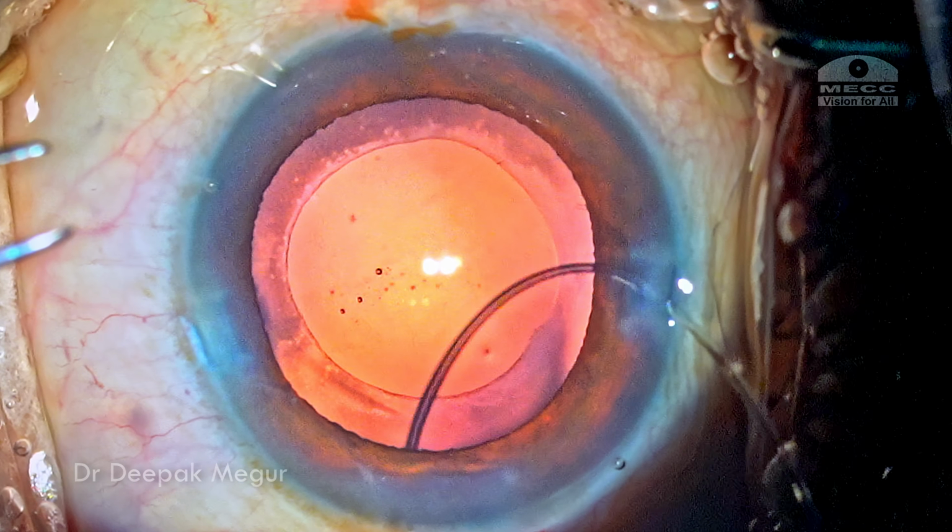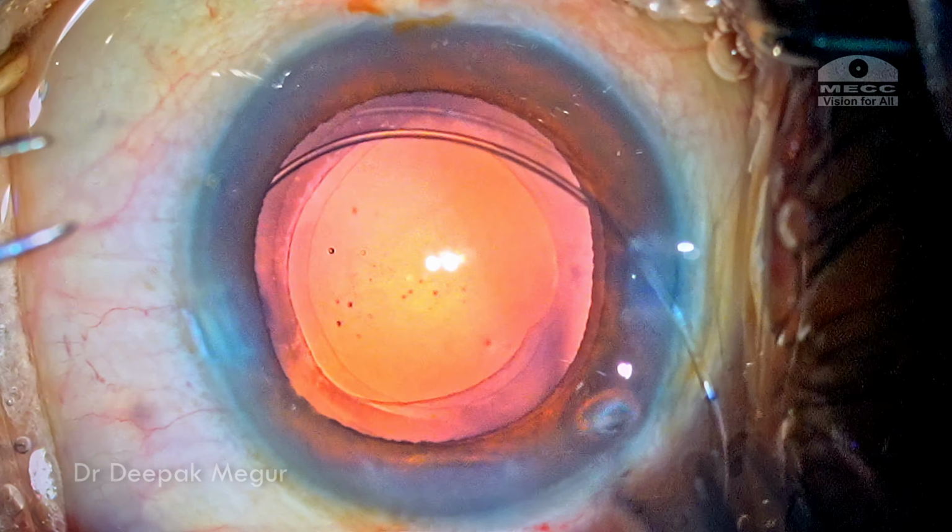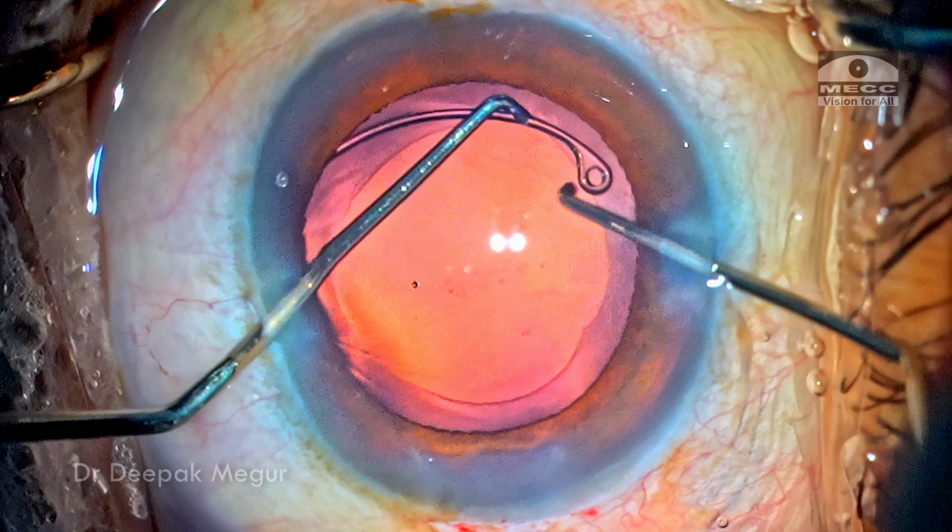So this was a small video demonstrating a posterior zonular weakness in one case, which was of course looking innocuous.